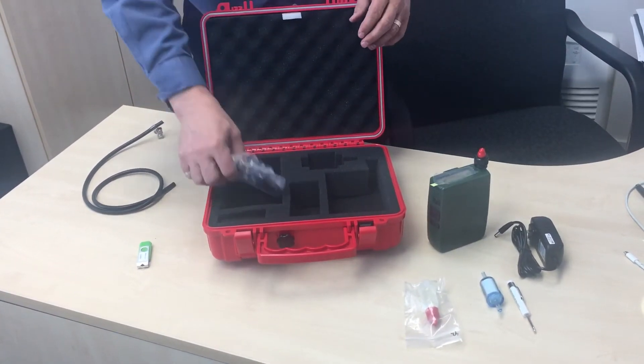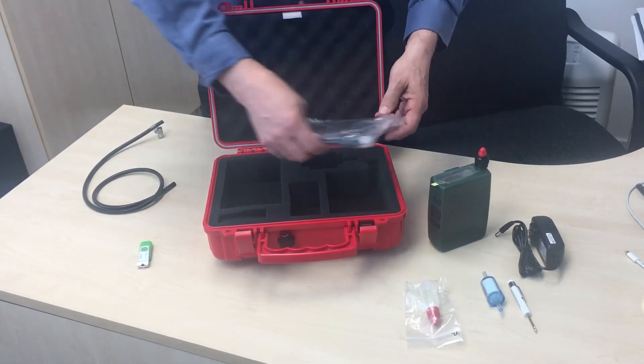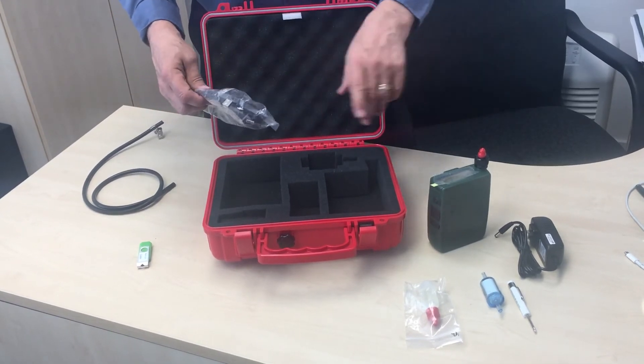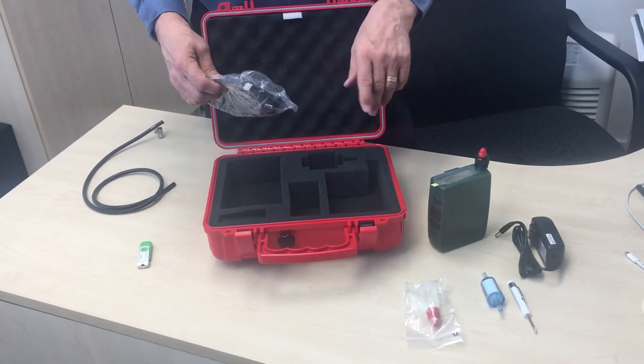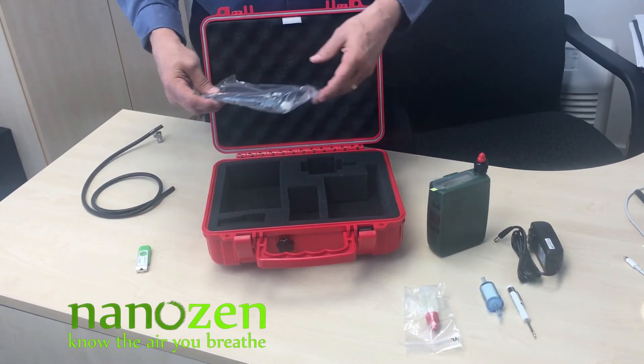Finally, there's a USB cable that you can plug into the unit and into your Mac or PC to control the unit and download data. You can also do communications through Bluetooth.